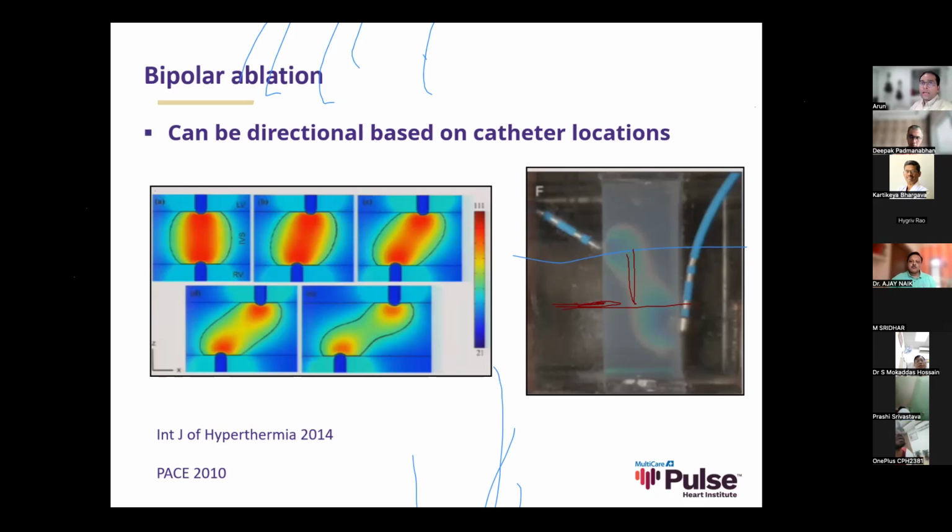So you can have a system where you are negating the respiratory variation and still be able to account for an impedance drop at the local level. So bottom line is you need to see what is happening live in the patient, and you might be able to assess what the impedance drop is at a local level if you assume that everything else in the system is remaining the same. But I'm not aware of any systems where they are measuring interface impedance actually.